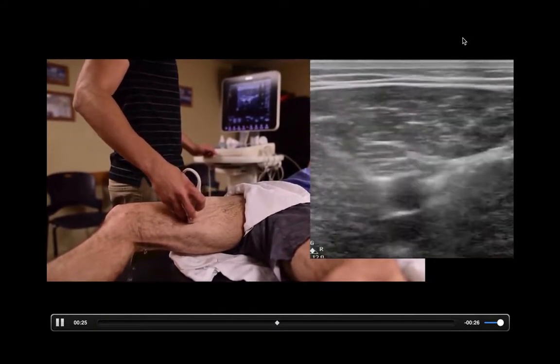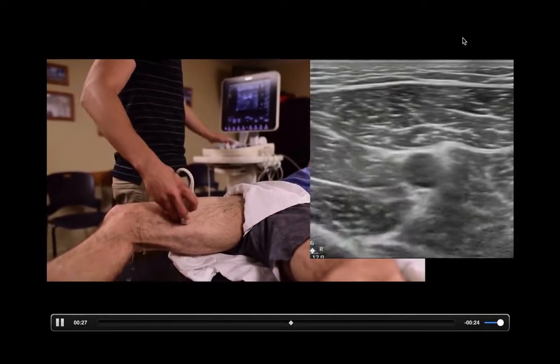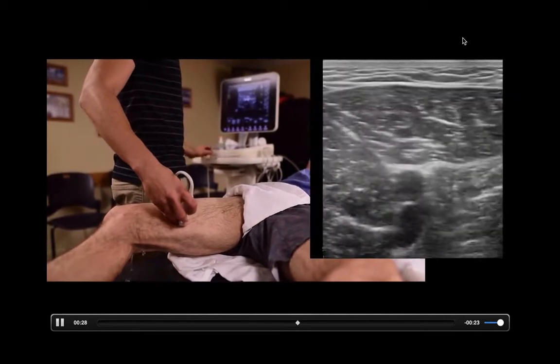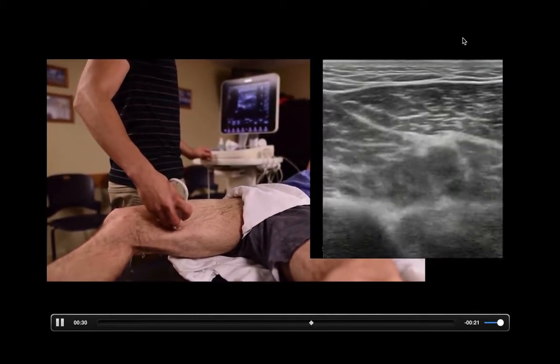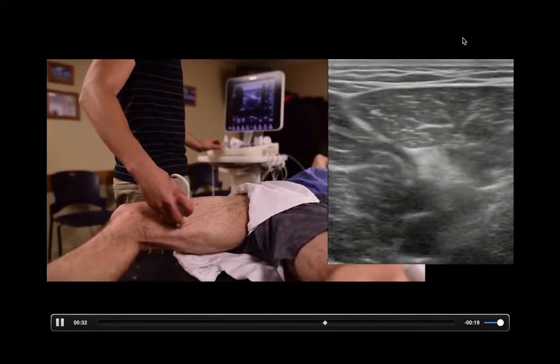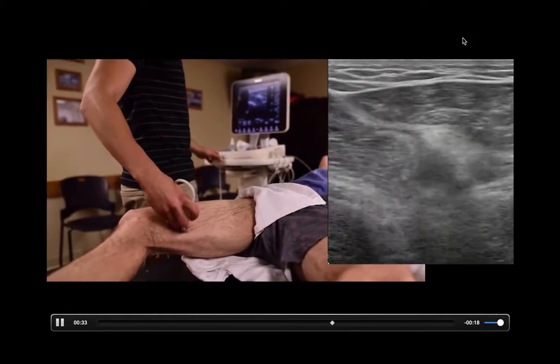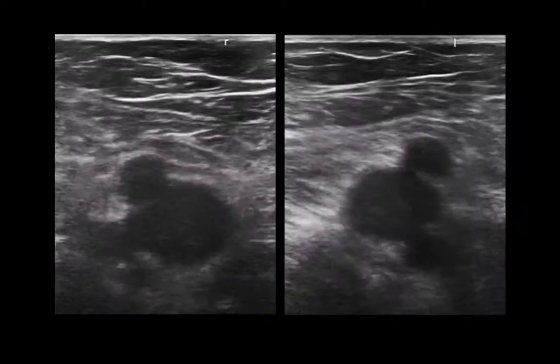That means there's nothing in the lumen that is blocking those vessel walls from touching. If you can get the anterior and posterior walls of the vein to touch, then there is nothing in that lumen that is obstructing those walls from touching — meaning no clot in that area.